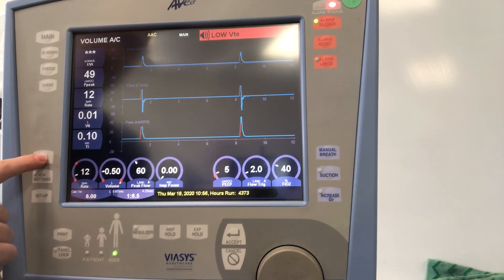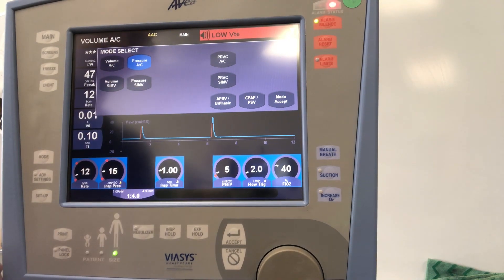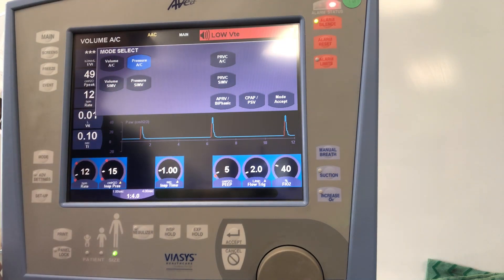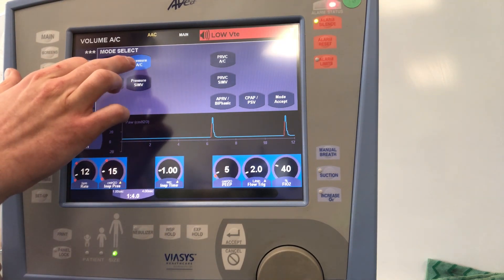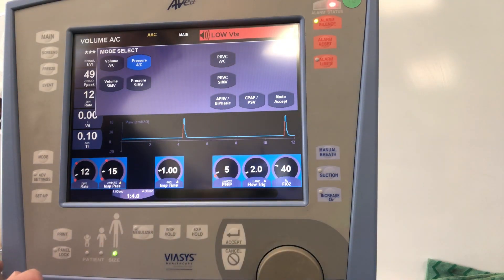To change modes, tap Mode. You can go into pressure AC, volume SIMV, or pressure SIMV. Today we're only going to cover volume and pressure AC. We're avoiding APRV and SIMV — unless you're using high rates on SIMV greater than 10, we don't recommend using it. APRV on the Avea is not fantastic; it has a lot of expiratory resistance and is quite asynchronous.